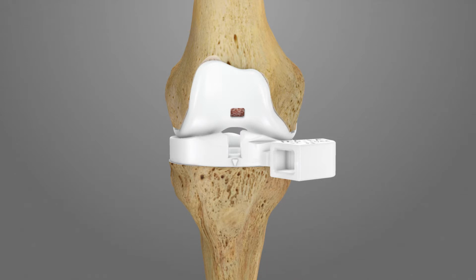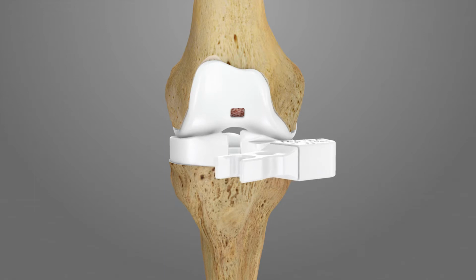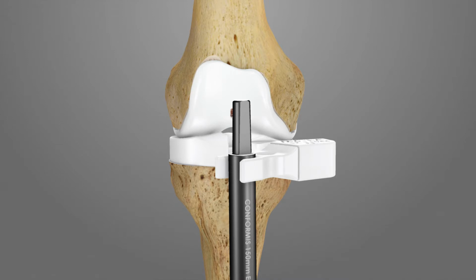There's approximately 1 mm of clearance around the T4 iJig to allow for intraoperative flexibility in rotational positioning. Confirm alignment by attaching the alignment rod adapter, A1, to the handle of T4 and snap an alignment rod onto A1. In the coronal view, verify that the alignment rod is parallel to the mechanical axis. In the sagittal view, the alignment rod will be perpendicular to the tibial slope.